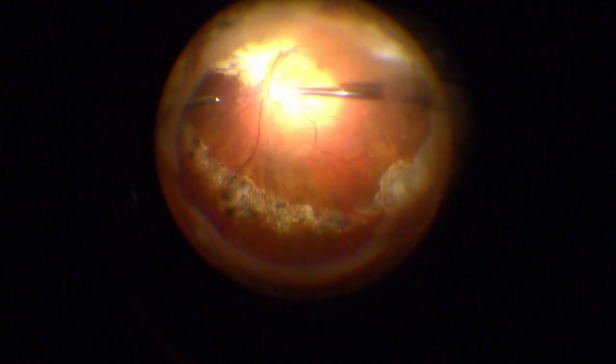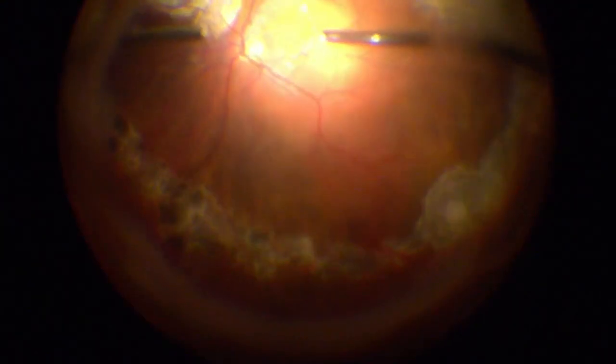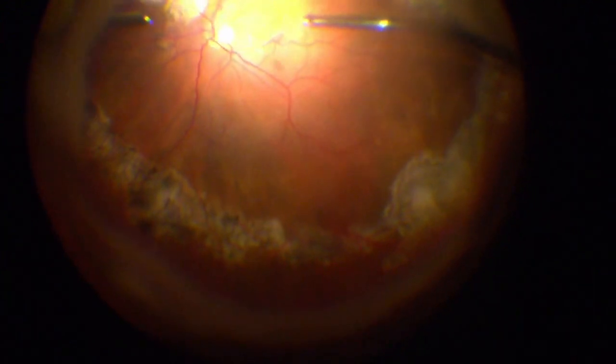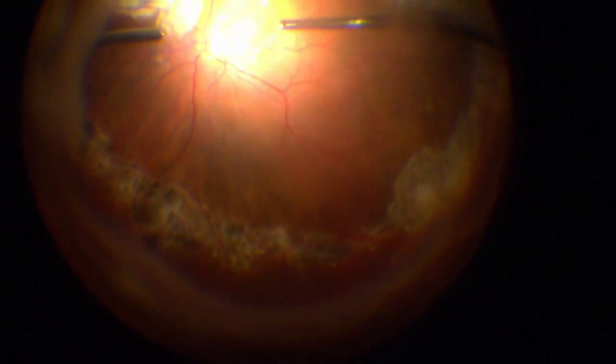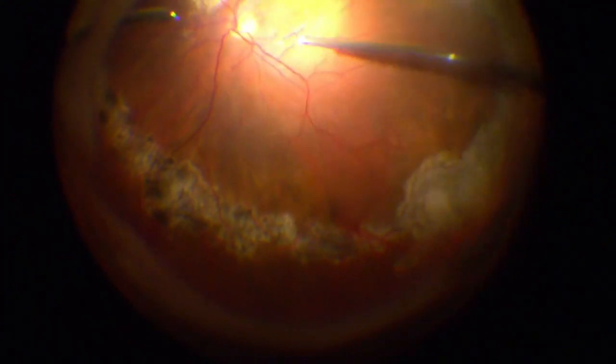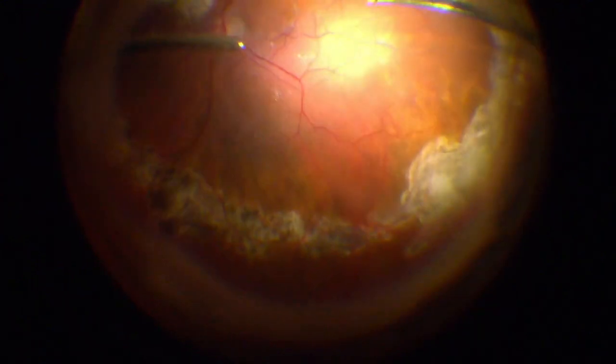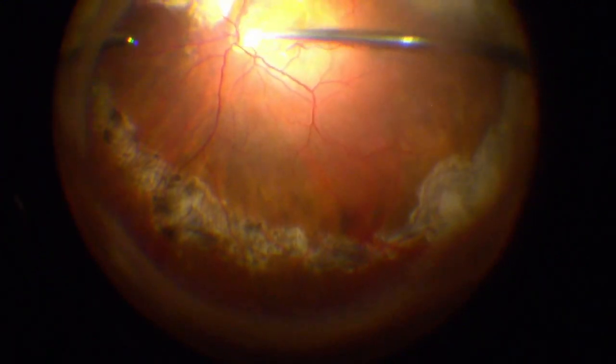This technically could be a tractional detachment. We're gonna go ahead and stain that. I'll try and zoom in a little bit so you can see what I'm looking at together. Very good. So we're looking at this tissue in particular, this big ridge here, distortion of the macula. How's our video doing?